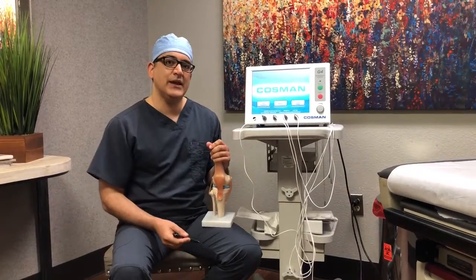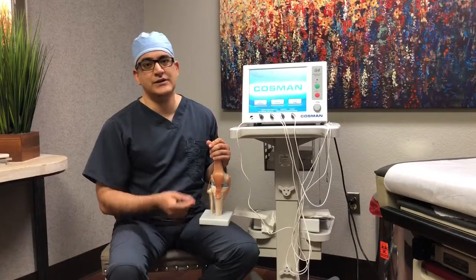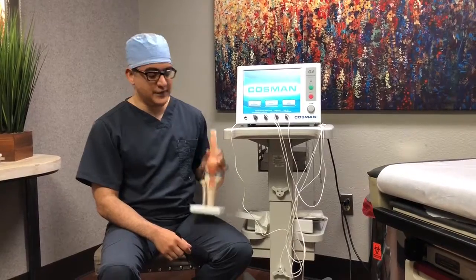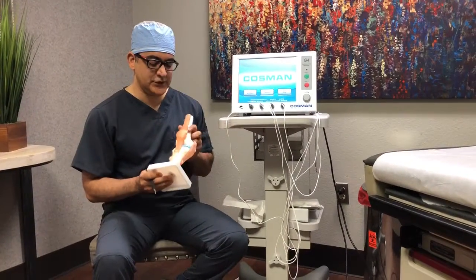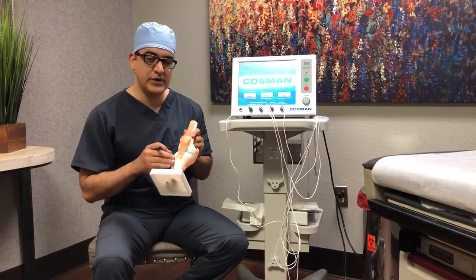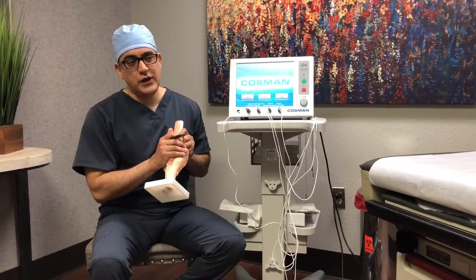Radiofrequency neurotomy, radiofrequency rhizotomy — all different names for the same treatment of the genicular nerves. Genicular nerves are three nerves that bring most of the pain signals from a knee joint.